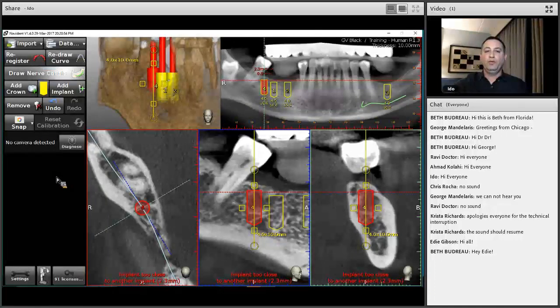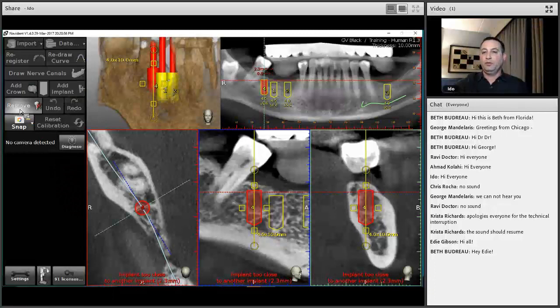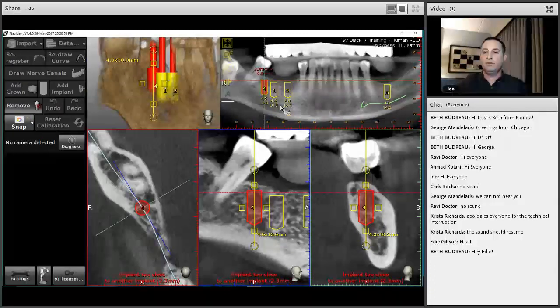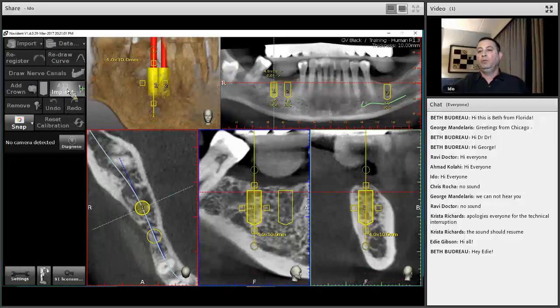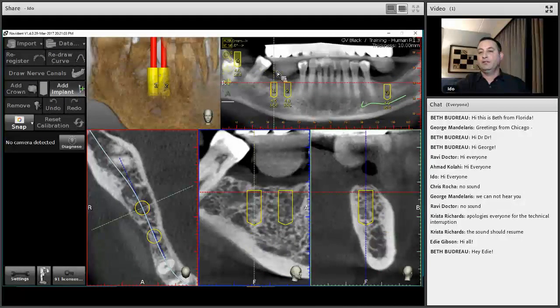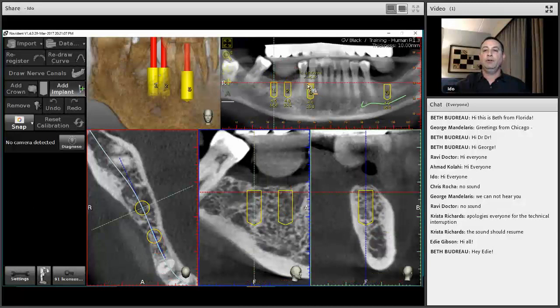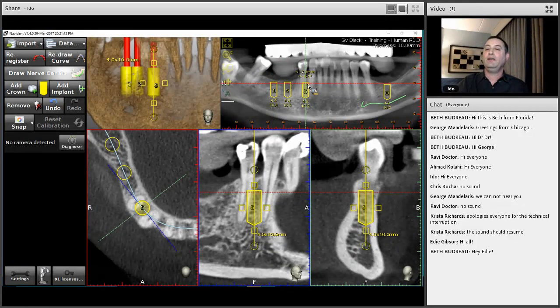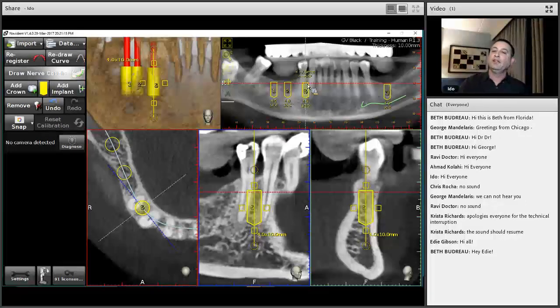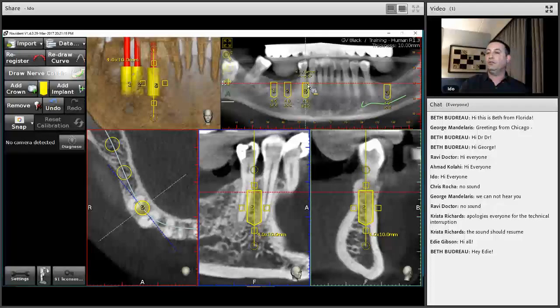If I remove implant number four and add a new implant, it will be numbered as five — each implant has its own number. So if you plan a treatment and are left with implants numbered three and five, there's nothing wrong with that. That's just how it works if you deleted some implants at a certain point.